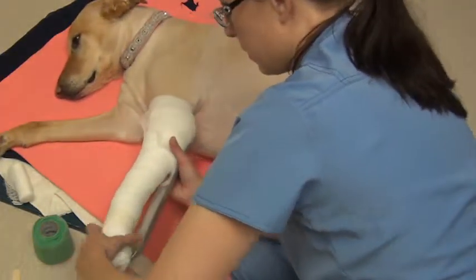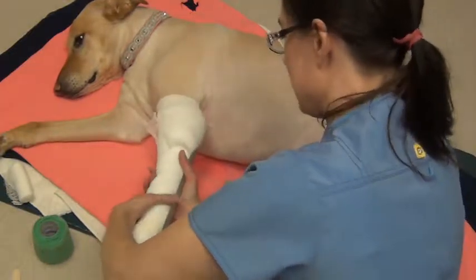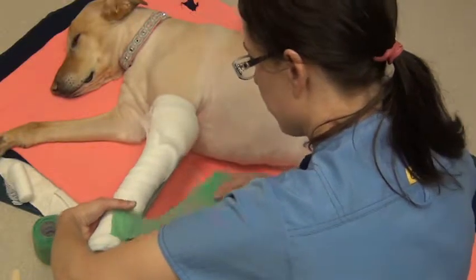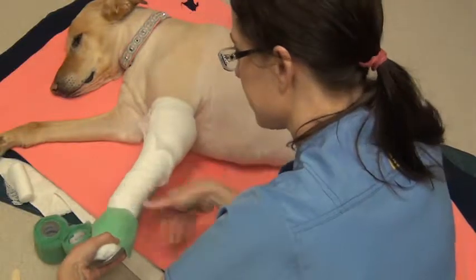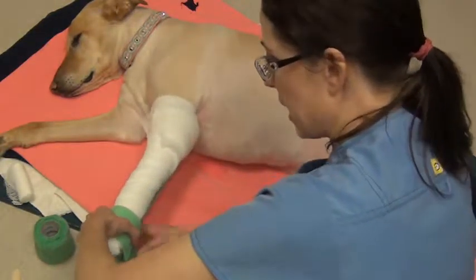So, obviously the cupped part is going to go down where her foot is. We're going to go ahead and start with our vet wrap. And this is a roll that I previously loosened. You don't want to put a lot of pressure or tighten these down at any stage.